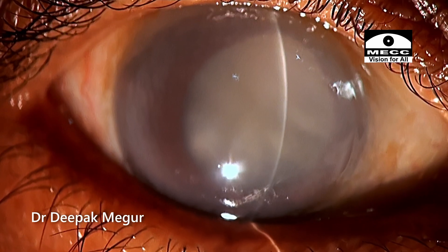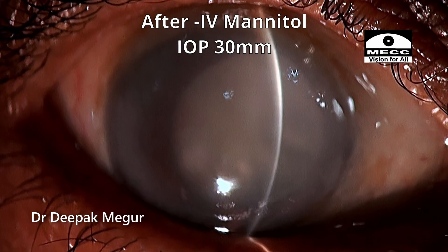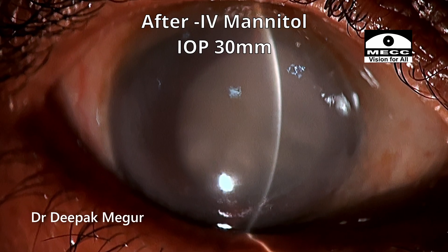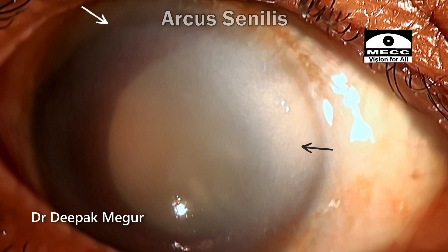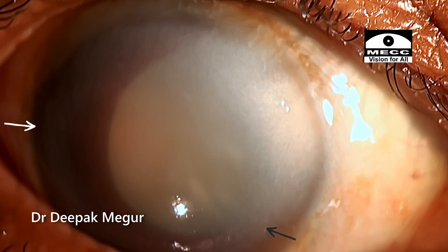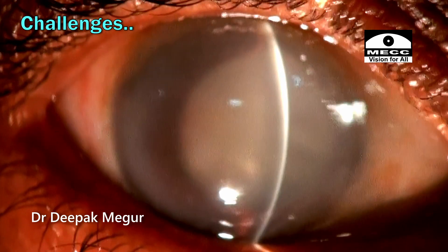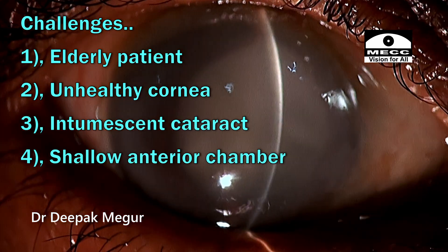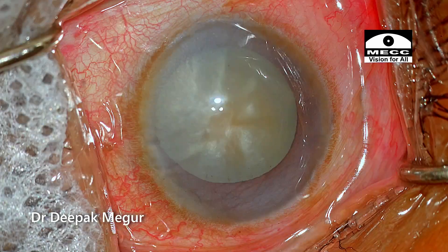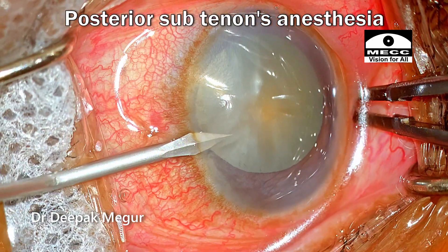Medications alone had not reduced the pressure significantly, so we decided to go ahead with the surgery. After mannitol, the pressure has come down to around 30 mmHg. On slit-lamp examination, we can see that there is a diffuse haze in the cornea and she has a profusely thick arcus senilis. The anterior chamber is extremely shallow — less than 2 mm as recorded by the biometer. So I have multiple challenges: a very elderly patient, unhealthy cornea, intumescent lens, a lot of inflammation, and an extremely shallow chamber. The surgery is being done under sub-Tenon's anaesthesia.